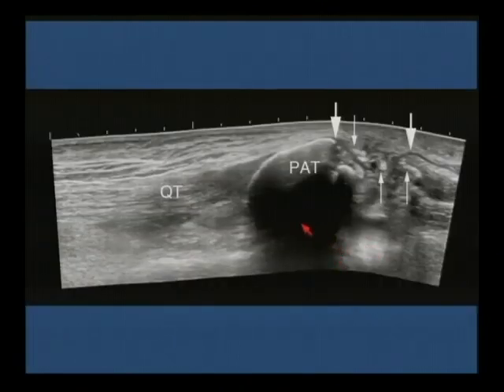And here's a longitudinal image, or sagittal image, if you like. Here's a normal quadriceps tendon. This is just dropout or anisotropy. It's a normal quadriceps tendon. Here's the patella, and actually you can see it looks like it's slightly tilted. And then there are several of those bony fragments, which we saw on the patient's radiographs. And there's a gap here. So this is chronic patellar tendon rupture, chronic patellar tendon tear.